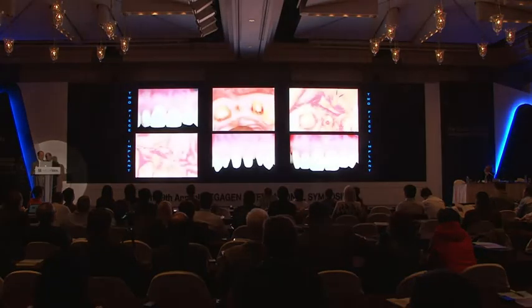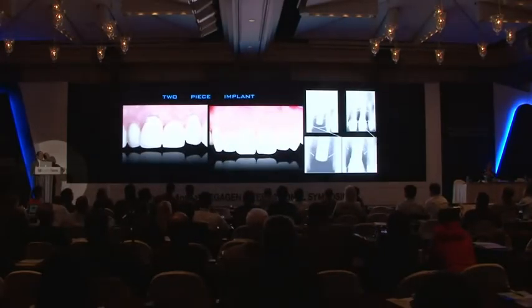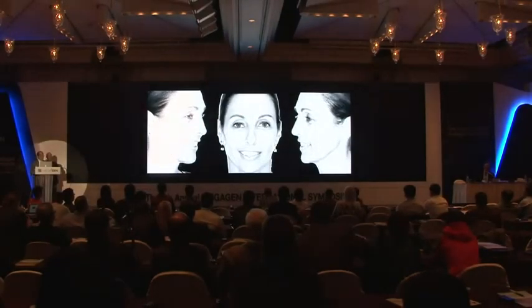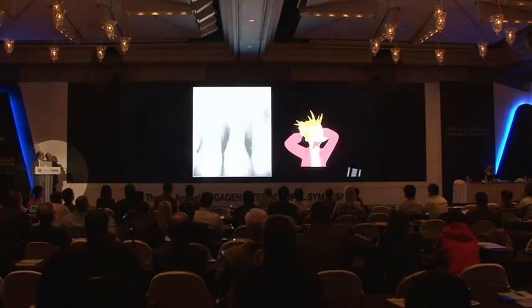This is the case of a young patient who wanted to rehabilitate her anterior teeth with single crowns. We inserted an implant with flat-to-flat connection between two teeth, and today's result is apparently very good. But at a distance of 2 years from the implant insertion, we have a crestal bone reabsorption of about 2.5 millimeters. We still have stable soft tissue because we still have the peak of the bone next to the adjacent teeth. However, if we lose this, we will be in trouble. The patient is still very satisfied with our work, but who knows how it will end.